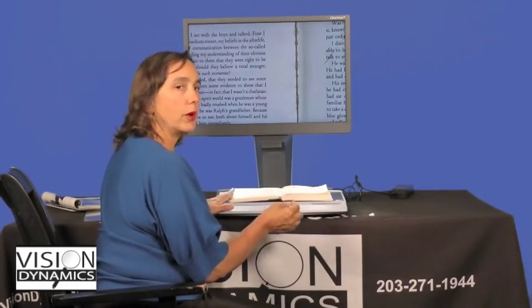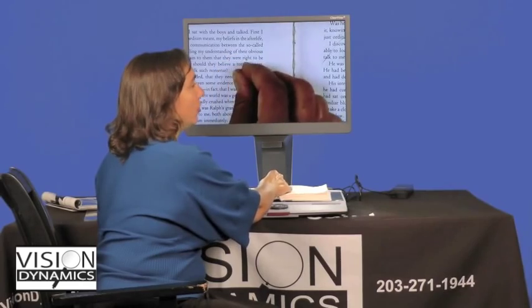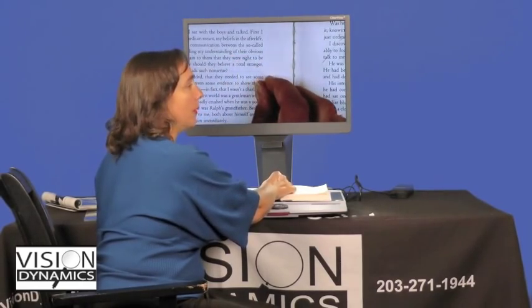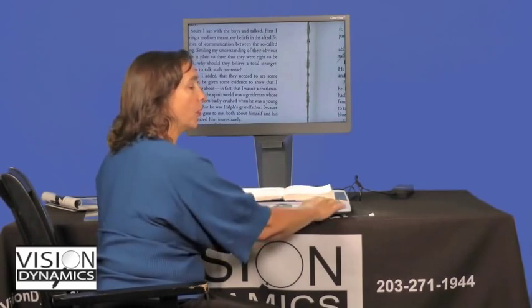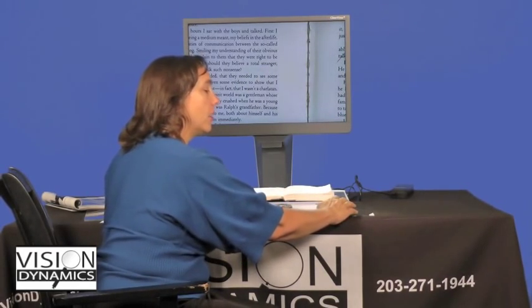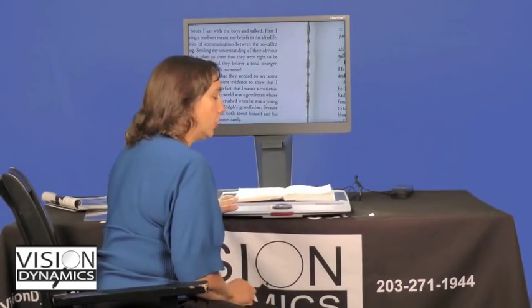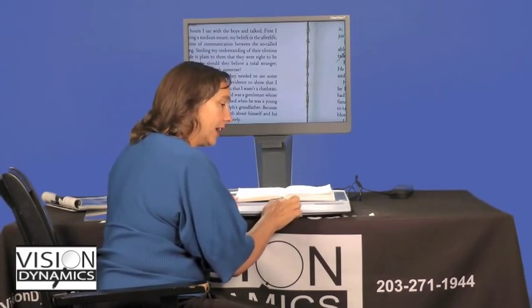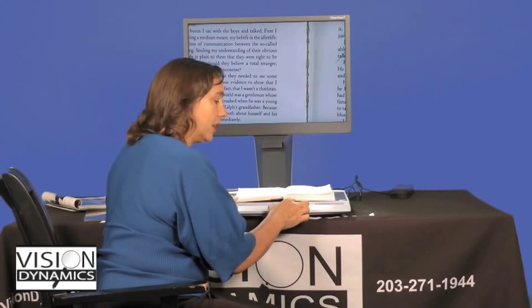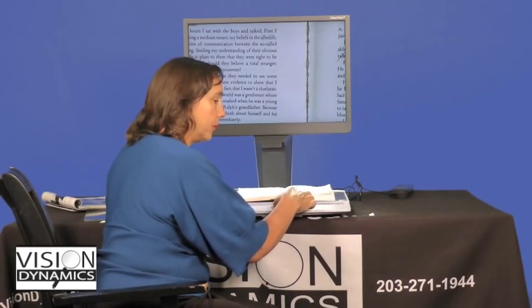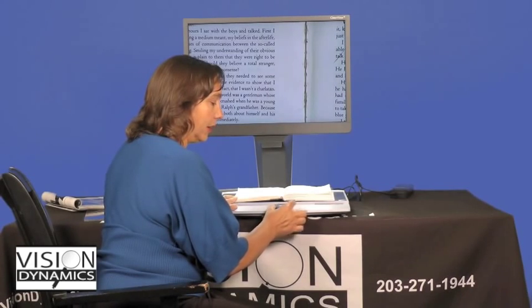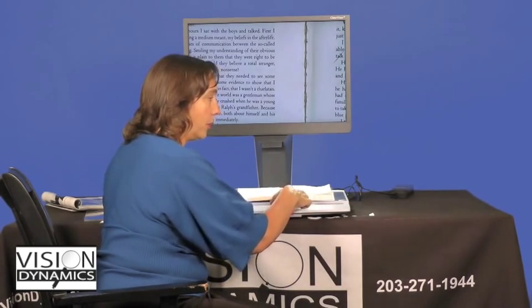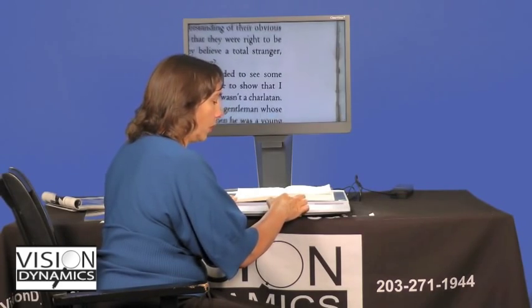Some people notice when they're writing that they can see the focus changing. It's following the pencil in their hand and not staying focused on the paper. So what you can do is press that pencil button. That's the focus lock. You know it's on because the light is going to turn on inside the stove dial. That's the main button here on the tray, the one that we turn to make the print larger or smaller.